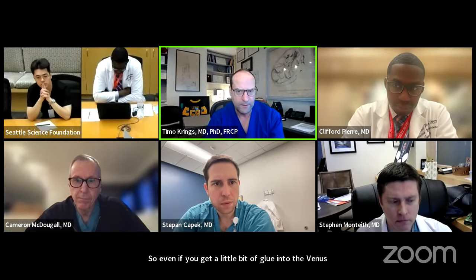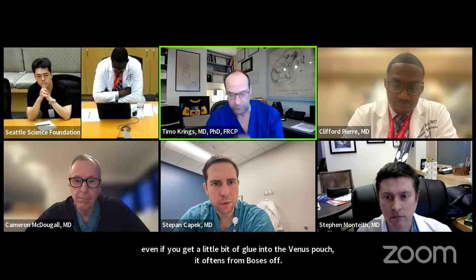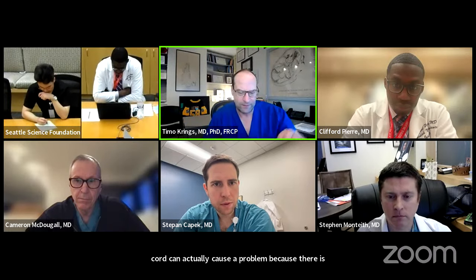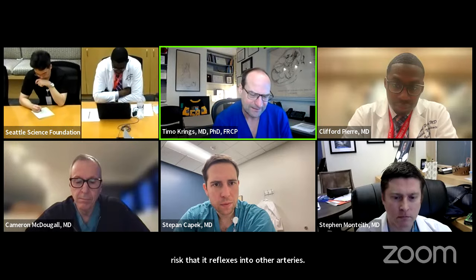Thanks. Yeah, thank you. Okay, so glue versus onyx. The major benefit of glue is that it is thrombogenic. So even if you get a little bit of glue into the venous pouch, it often thromboses off. The major benefit, of course, of onyx is that it goes into all of the different arteries, which for the spinal cord can actually cause a problem because there is a risk that it refluxes into other arteries. And that therefore you may have inadvertent embolizations.